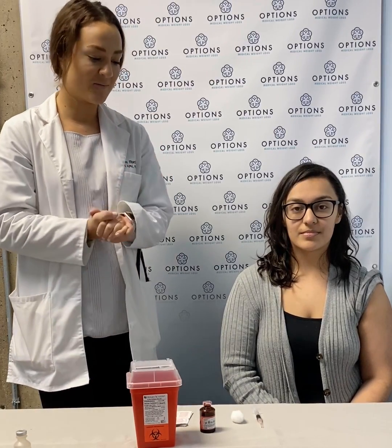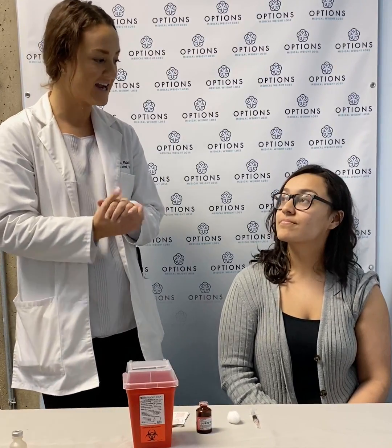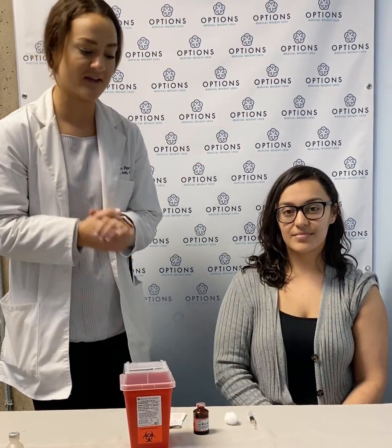Hi everyone, my name is Lauren. I am the nurse practitioner provider at Options Medical Weight Loss, our self-loop location. Today we are going to walk through how to do an intramuscular self-injection of our lipotropic here. I have Leslie who is going to demonstrate for everyone and will take you along with us.